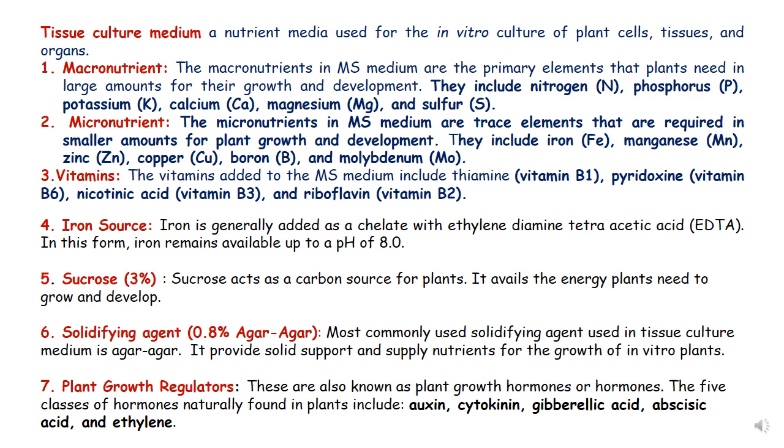So here in this slide, you can see that every line is referring to MS medium, because MS medium is the most widely used medium in tissue culture. You can make any media like LS medium, Gamborg medium, NP medium, Nitsch medium, but we will be referring to MS medium everywhere because that is the most widely used medium in tissue culture labs. Now we were discussing the third component. So third component is vitamin.